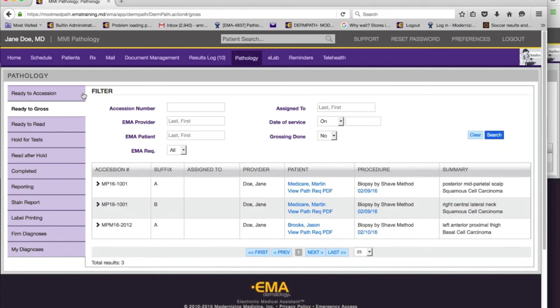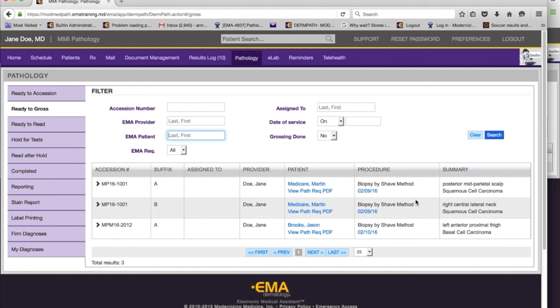Once you accession, cases move to the grossing screen. Here are the three cases I just did. We give you multiple ways to find cases. If you have a handheld barcode scanner and use the slide labels we print with barcodes, you can scan the barcode and it will pre-populate the accession number to find that case. Otherwise, you can search by patient, by a specific provider that did the biopsy, or other filters. We give you multiple ways to find the requisition or specimen.